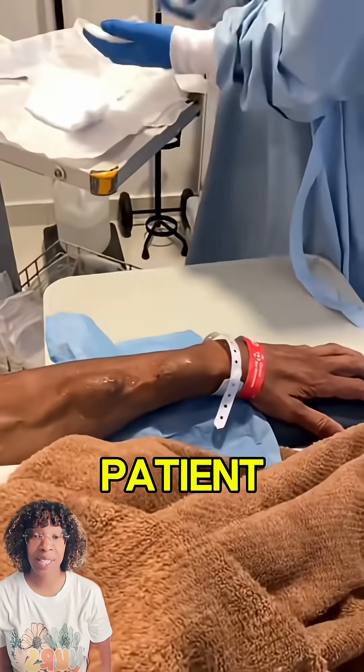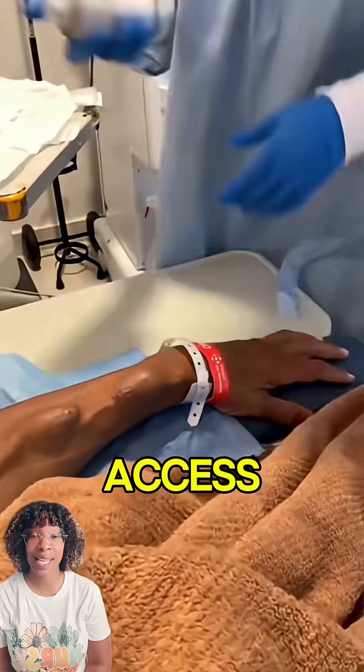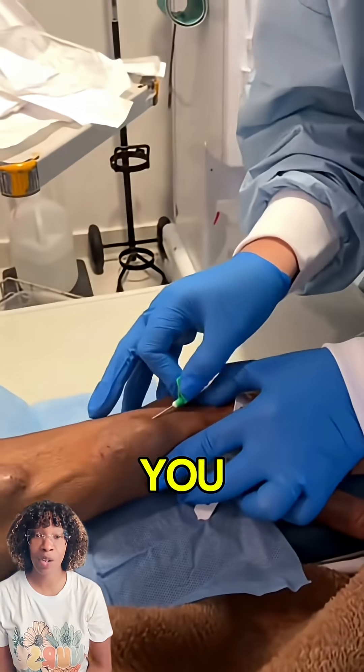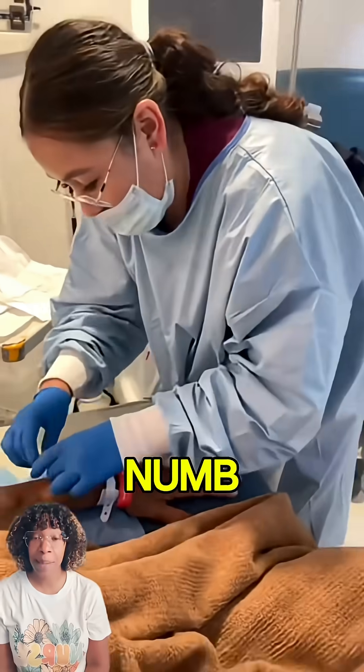This is a dialysis patient that's getting ready to be put on the machine. Of course, you're cleaning both access sites. The numbing spray is not always necessary — you can put lidocaine cream on 30 minutes to an hour before to numb it.